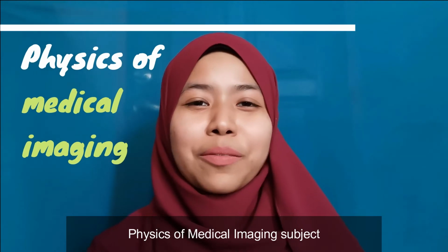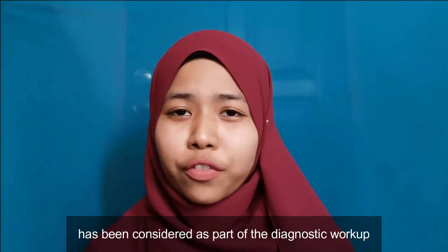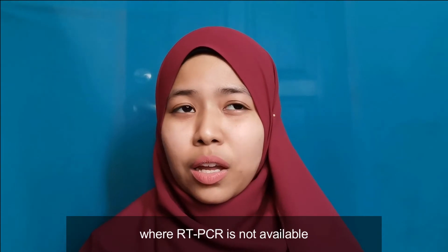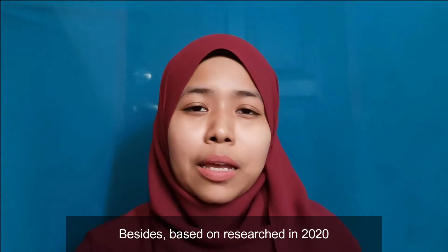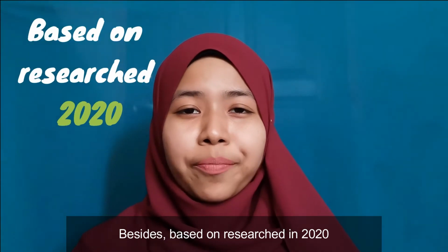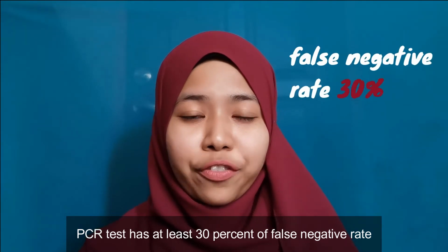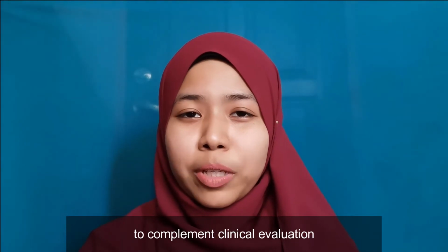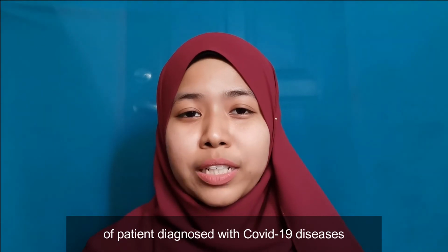This video was dedicated for the physics of medical imaging subject. Chest imaging has been considered as part of the diagnostic workup of patients suspected with COVID-19 disease, where the RT-PCR test is not available. Besides, based on research in 2020, the PCR test has at least a 30% false negative rate. Thus, chest imaging has been considered to complement clinical evaluation and laboratory parameters of patients diagnosed with COVID-19 disease.